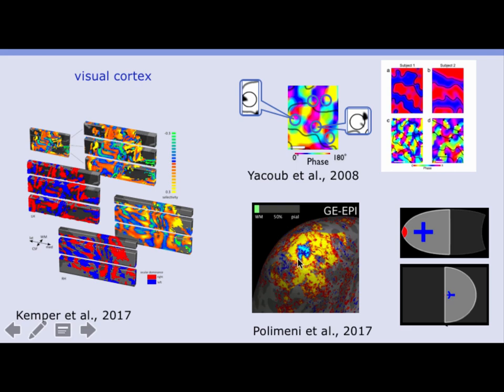And here in this animation, Jonathan is going through the different cortical depths, starting from the gray matter, white matter border, where you can see that it's mostly noisy and limited. Now you see it limited by SNR. If you have the middle cortical layers, you can nicely distinguish the cross. And in the upper cortical layers, close to CSF, you have these scrambled patterns because of all the large draining veins, even though there you have the highest sensitivity. So by going through different cortical depths, you can choose your compromise of sensitivity versus specificity.